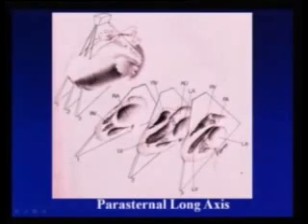With a non-restricted perimembranous VSD, a posteriorly placed great vessel overrides the septum, whether it is the pulmonary artery or aorta, because in TGA here you will get the pulmonary artery. Okay, so again you have to define whether it is the pulmonary artery or the aorta, and you will get overriding of the pulmonary artery here. And with further anterior tilt from parasternal long axis, you will get the pulmonary artery arising from the right ventricle.